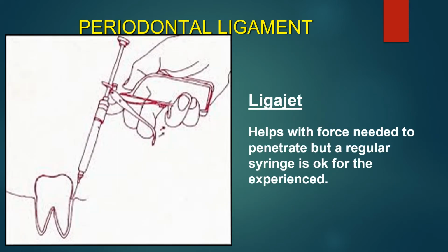This device is just one device. It's called a Ligajet, and some of you who have been assistants may remember your dentist giving this. I never saw too many that my dentist gave. It looks like it would be so gruesome, but the patients did not seem to mind, and in fact they minded less over this than a conventional injection.